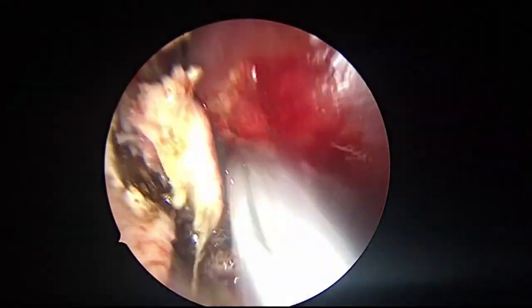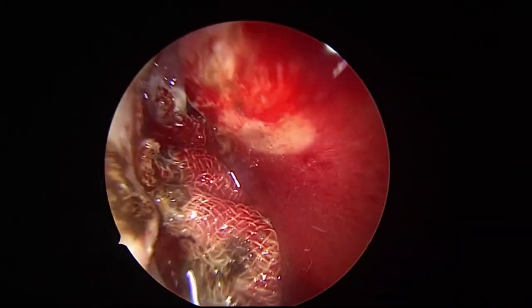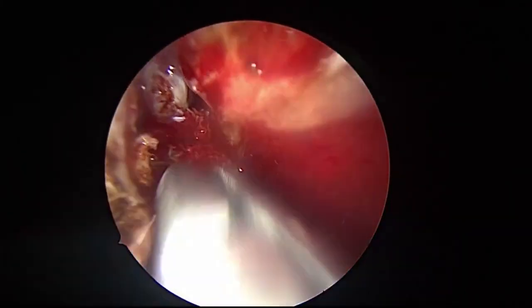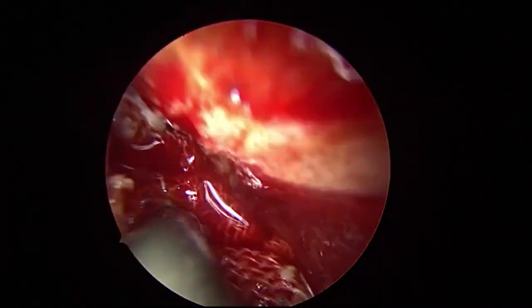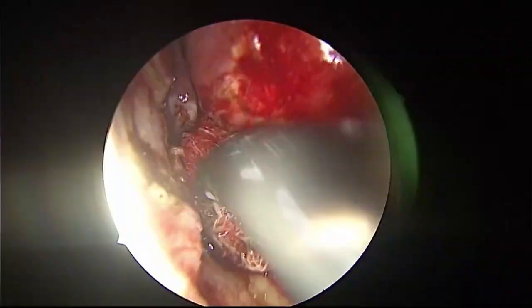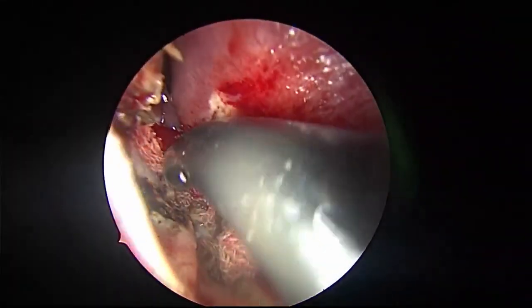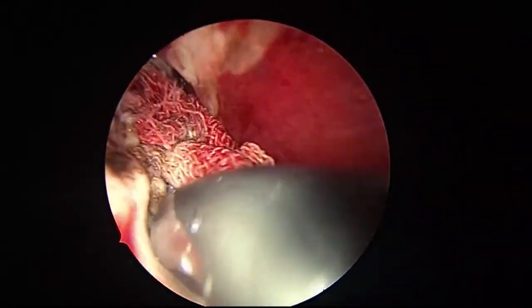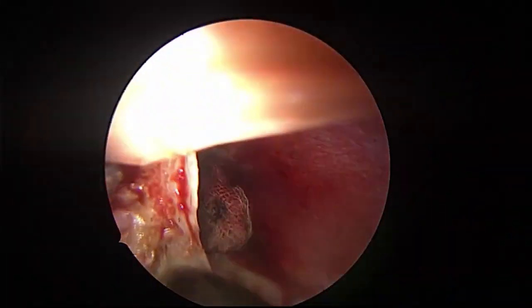That's the inferior turbinate, part of it anteriorly. See this? It has a major vessel coming from behind as a branch of the sphenopalatine. See the visualization, how it is maintained. Coagulator everywhere. See the medial wall completely exposed.